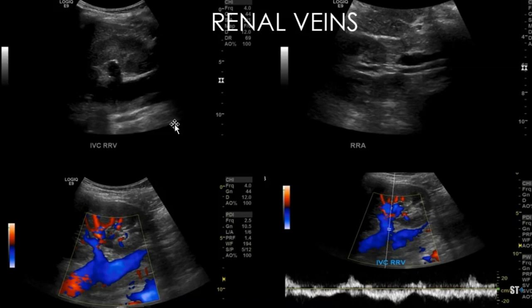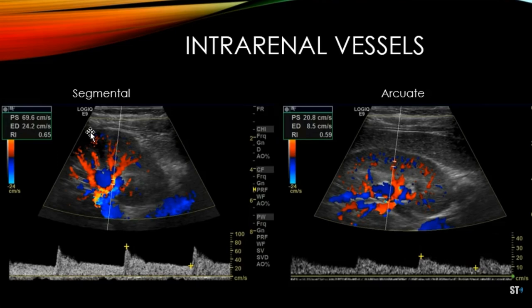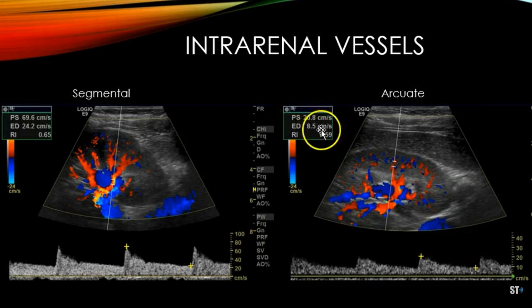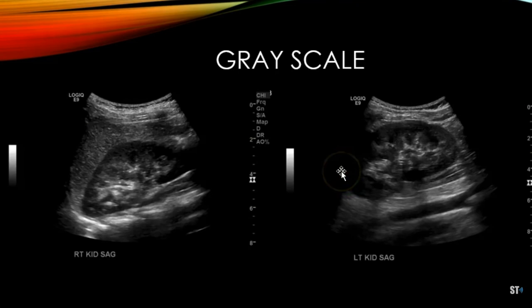Now to the intra-renal vessels. The AIUM protocol says you've got to do the segmentals in the superior, mid, and inferior poles of the kidney. There's always going to be some variability from institution to institution. Here is a Doppler with a segmental — a very nice waveform at 70 centimeters per second. The resistive index is 0.65, which is normal. As you go further up the cortex, your velocity will be lower because the arteries are smaller. Here, the arcuate is 21 centimeters per second with a resistive index of 0.59. You also want to do grayscale images of both kidneys to check for renal asymmetry and to see if there are any masses, cysts, increased echogenicities, or anything like that.